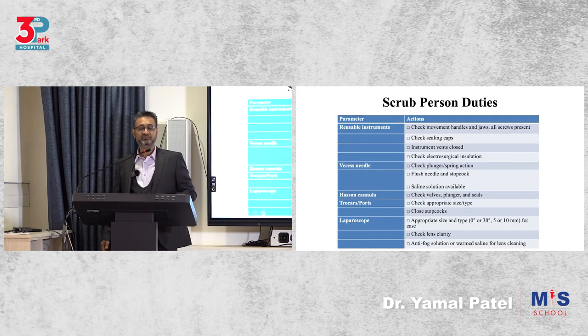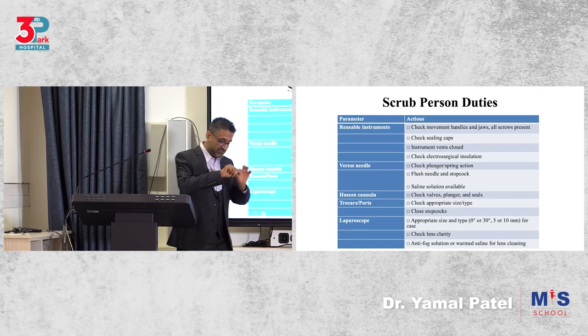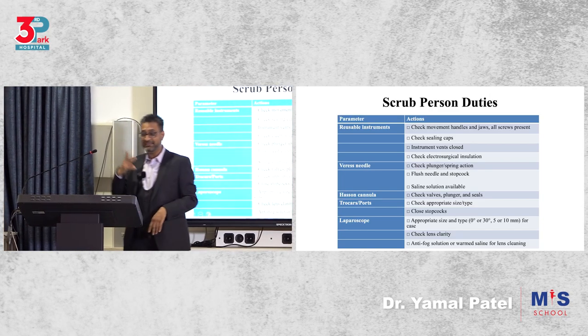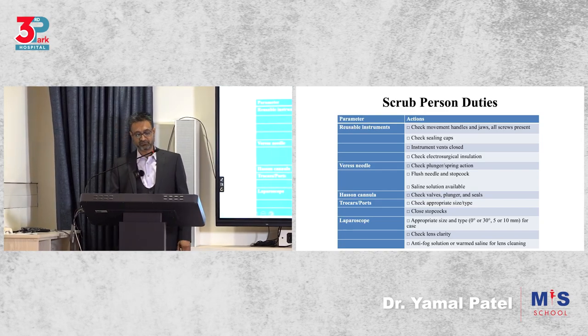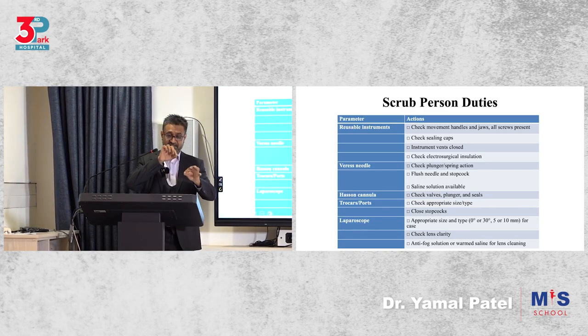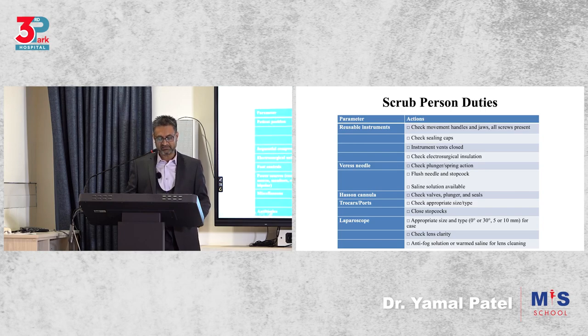What about my scrub person? My scrub person's checklist could be the following. Did I check, did I connect my instrument? Did I see it's open? Is my insulation correct? Is it opening and closing? Is it not at the last minute when I ask for it? Is the Veress needle spring okay? Is it patent? Is the valve opening? So you're checking all this before you start. Okay, that's called a checklist.